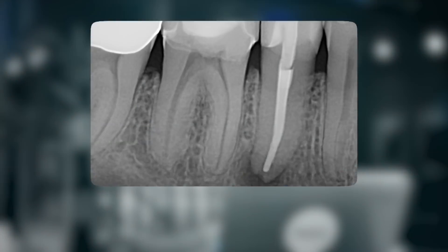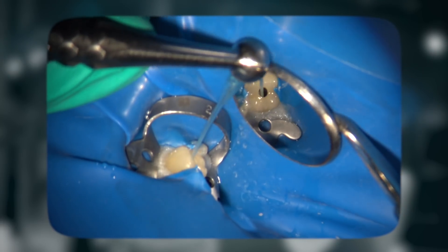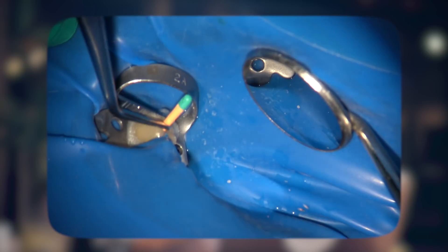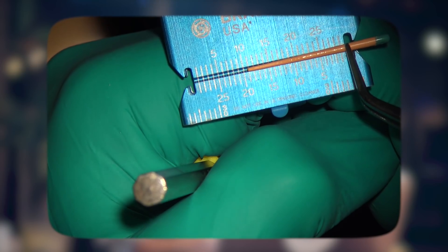This is remarkable considering the size of the gutta-percha that was present, and at this point we only used really two instruments in this root. The canal was then dried after further irrigation, and given its originally large diameter, I went off the bat and used a 70-04 bioceramic-coated cone to check the fit. Anatomical shaping requires a little bit of cone fitting at the end because the right cone has to fit to the length and have a little tug-back, since the shape is anatomical and hasn't been carved into the canal using round files.